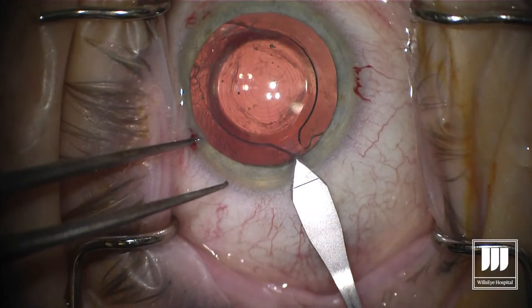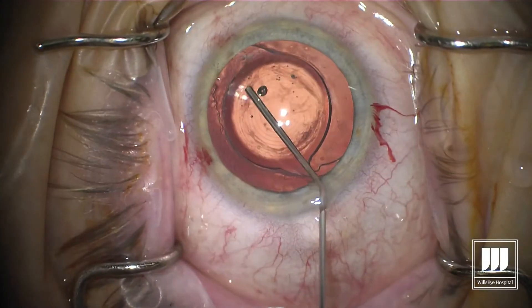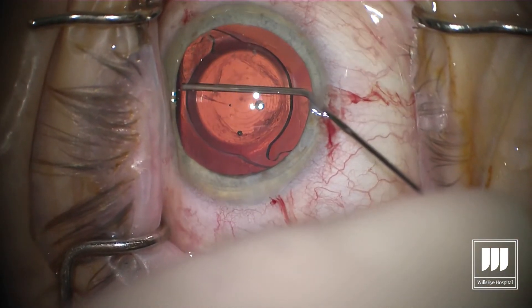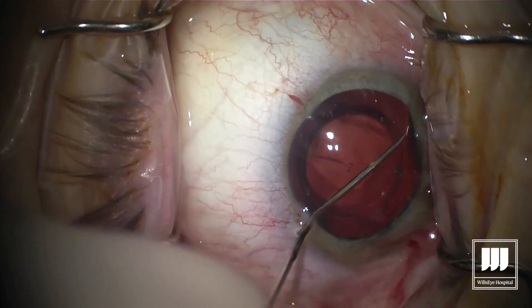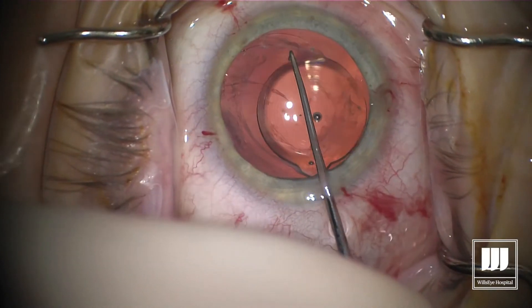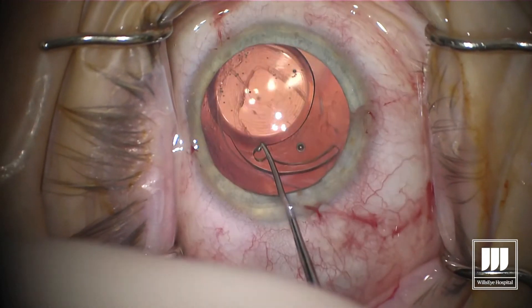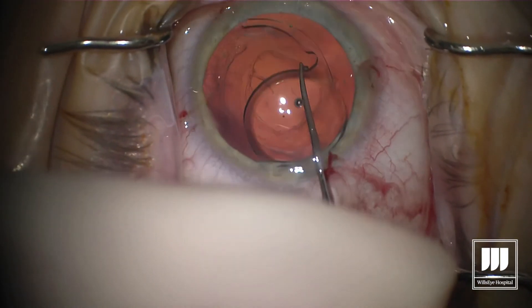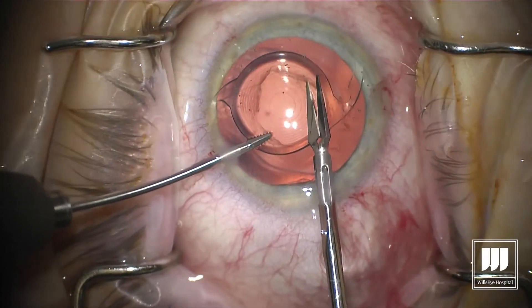Another example of an open posterior capsule: a multifocal IOL on the Johnson & Johnson platform, so we need to work at that haptic-optic junction — and we have an open posterior capsule. We go in with OVD, finding the easiest entry point between the leaflets right at the haptic-optic junction, extending it and ballooning up the capsule. We go 360 degrees to open the capsular bag safely. It's very important in this case to keep the anterior rhexis. Once the implant is freed, we use a lifting move to bring it into the anterior chamber — this is a lift, not a spin. Then with micro scissors and micro forcep, we cut the implant into two or three pieces.